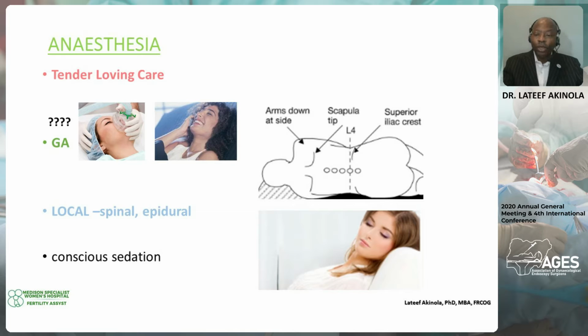Most times we use tender loving care, especially if you're in the office, or conscious sedation when you are doing office hysteroscopy. We generally avoid general anesthesia these days, and of course we can use spinal or epidural, depending on whether you are doing this in the office or you are doing it in the theater.